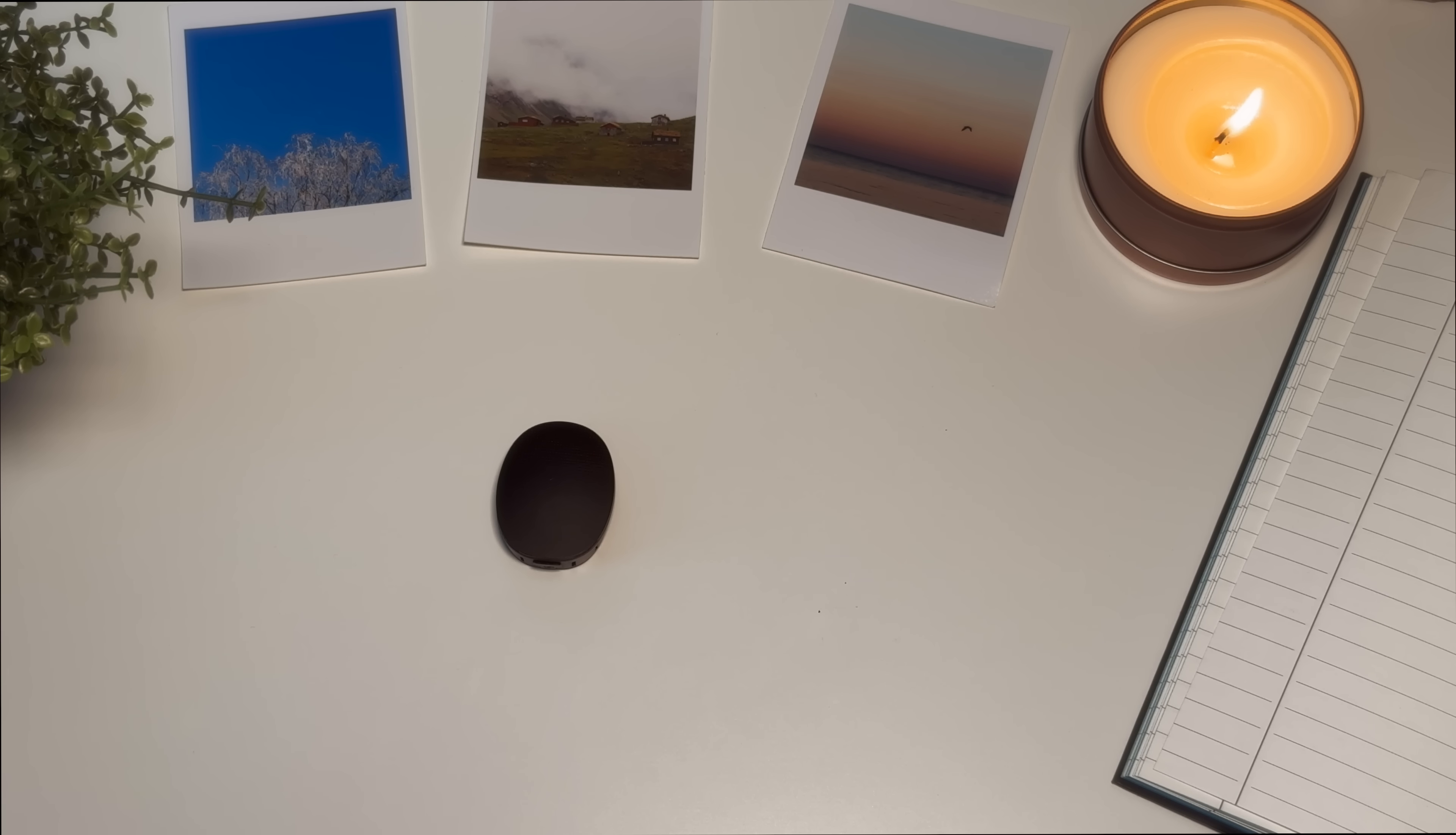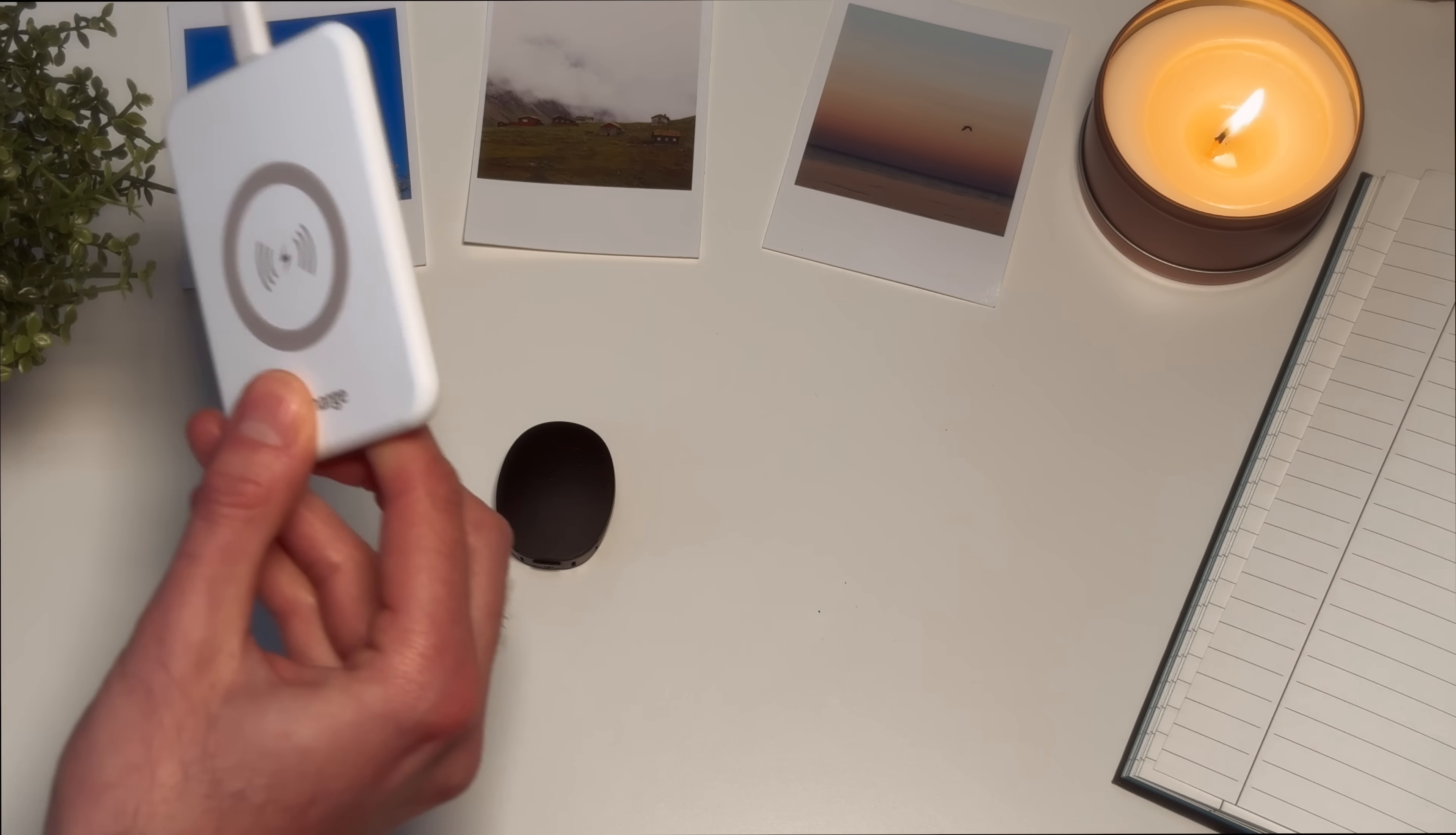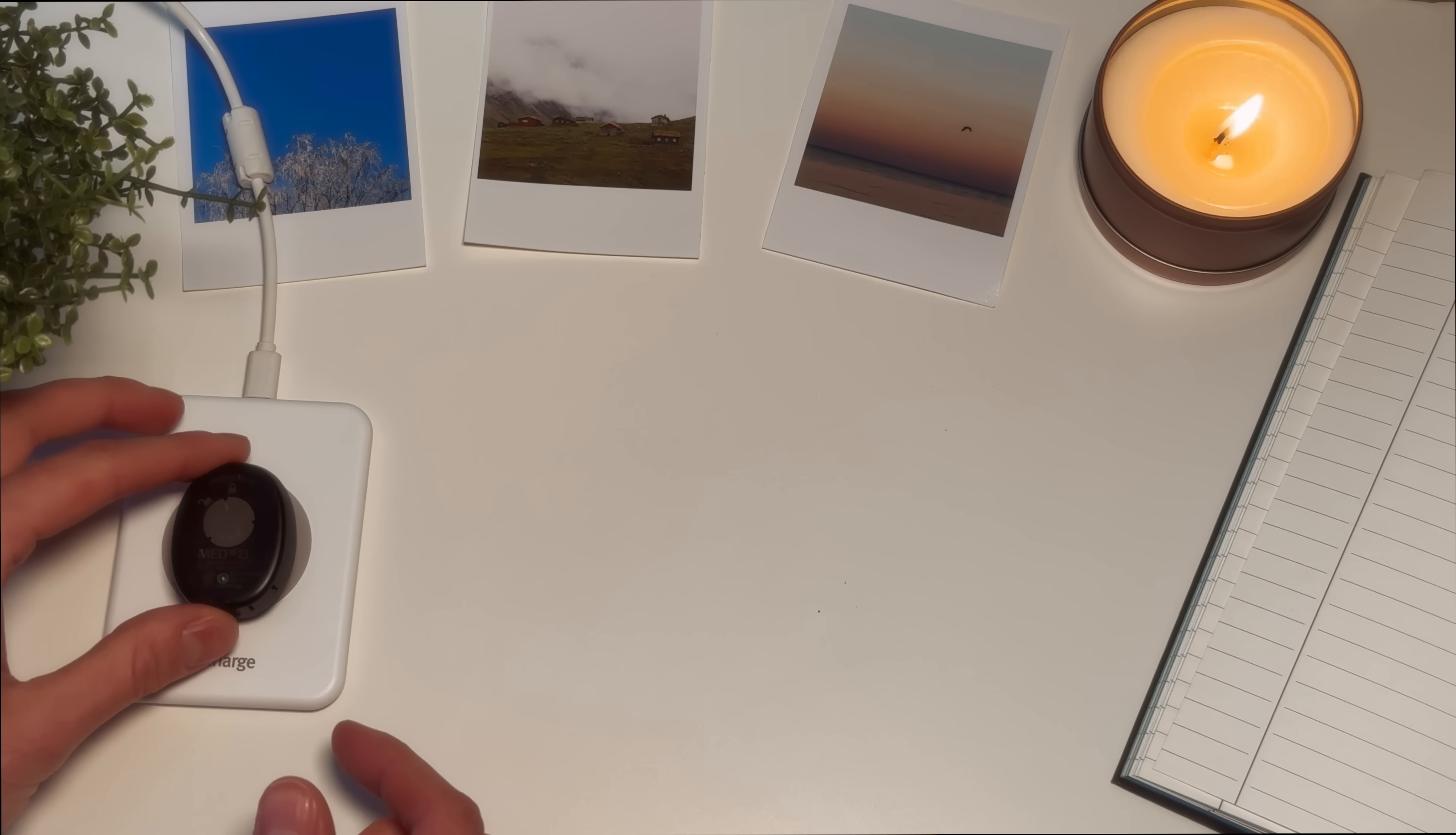Want to know what the different lights mean on your RONDO 3 audio processor? Let's take a look! RONDO 3 has two indicator lights illuminating or blinking with different patterns and colors to indicate different conditions. The indicator light on the front of the processor is the main indicator light and the indicator light on the back is the charging indicator light.